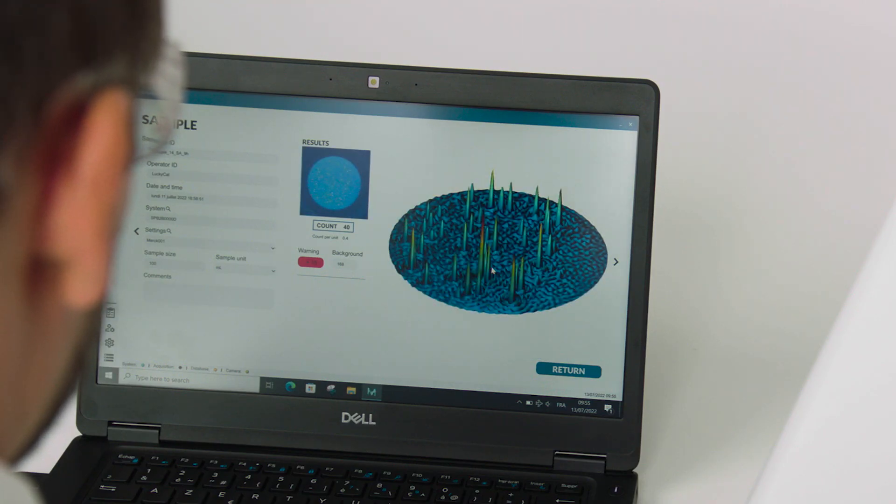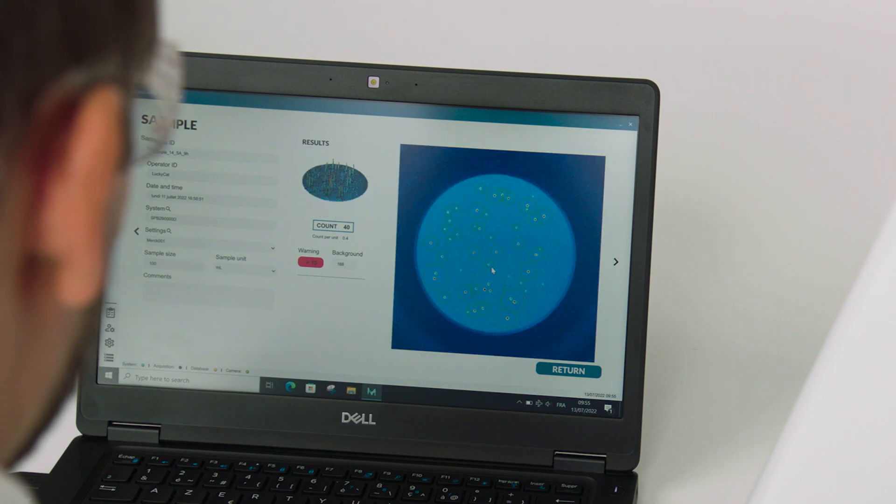The data, including the electronic image, is stored for later downloading, printing and retrieval.